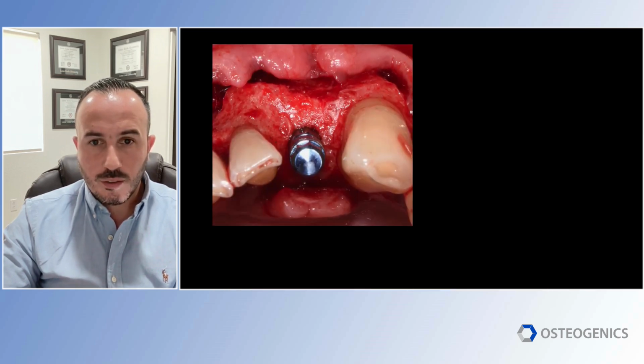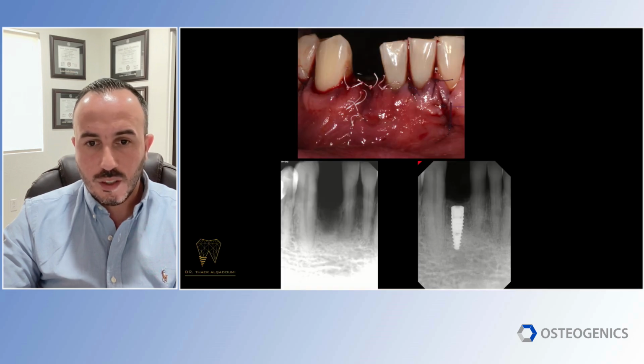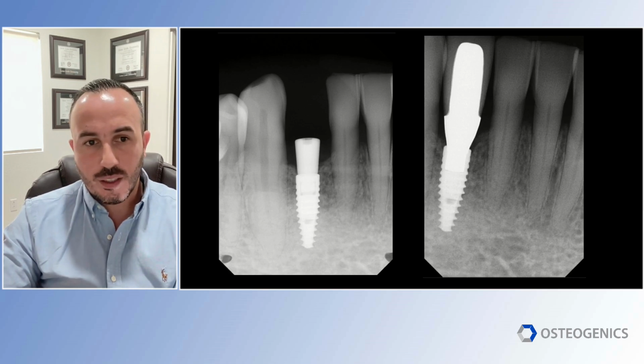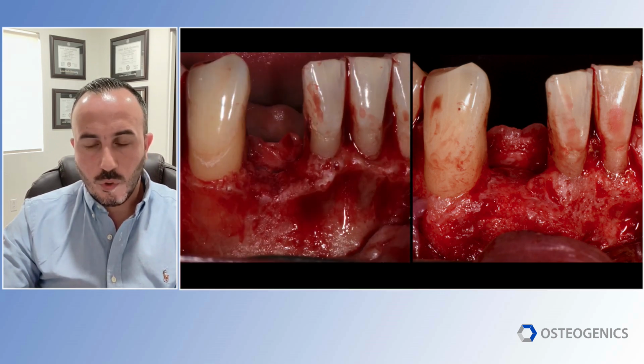So we place the implant, and then we try to manage the soft tissue part by adding autogenous connective tissue graft to get more vertical height and close back. And this is how it looked at the day of the uncovery. Nice tissue, nice thickness, tissue and bone. And this is what I got back, periapical x-ray from the restorative dentist 1 year after. So this is after, and this is before. You can notice the adjacent teeth, also the amount of regeneration that we got on these.